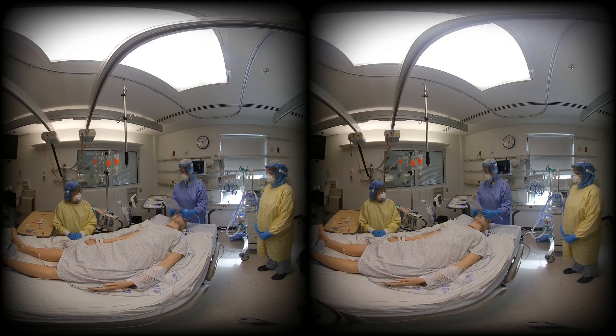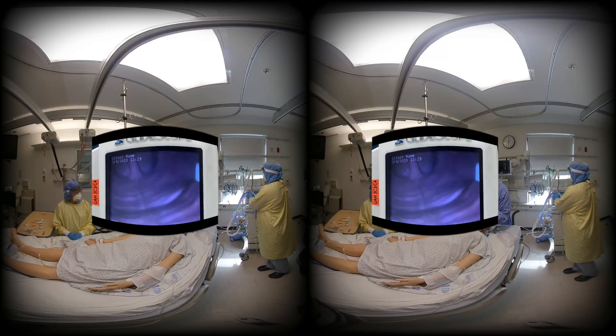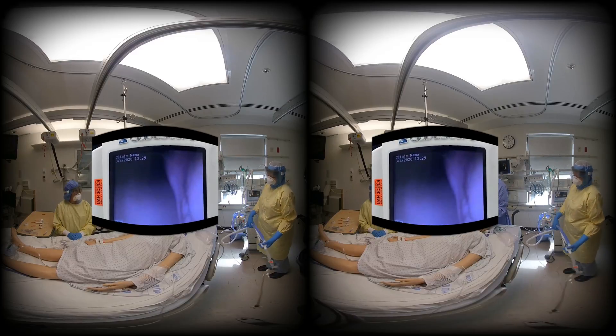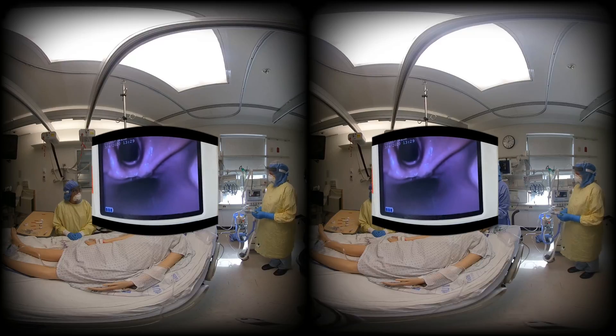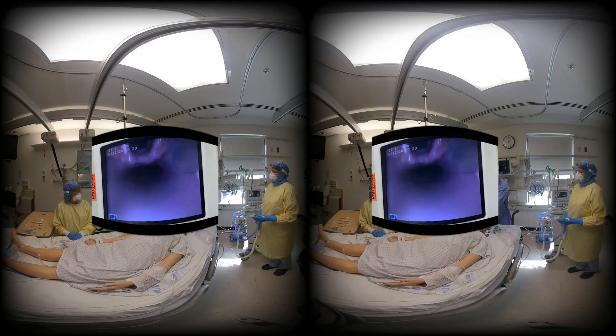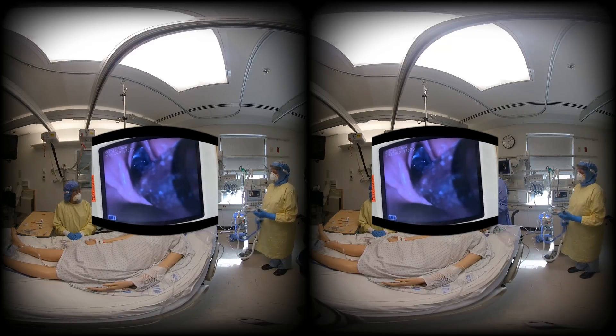Video laryngoscopy is heavily encouraged as the standard method for intubation in this patient population, as it minimizes the need to look directly down the airway, unless contraindications exist for this approach. Medication will be administered for rapid sequence intubation. Bag valve mask ventilation will be avoided unless the patient has life-threatening desaturation.